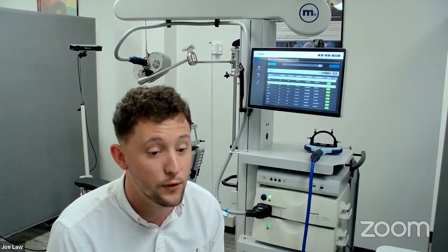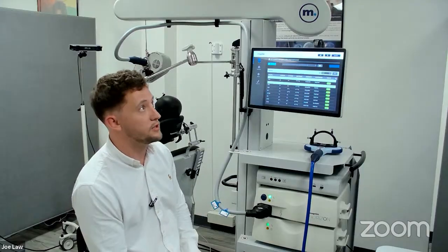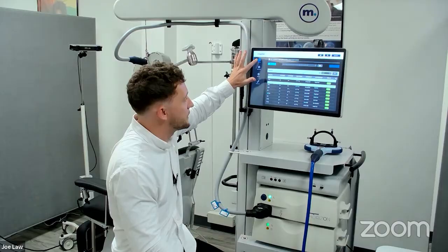I think we have time. Can you change the total number of sessions for a specific protocol? So I think what they're asking for is, can they adjust around a specific protocol? Okay, yeah. So sessions, yes, you can do, for example, sessions.